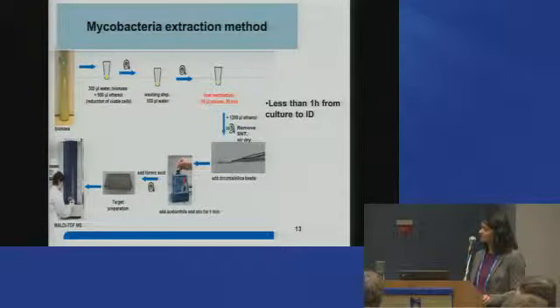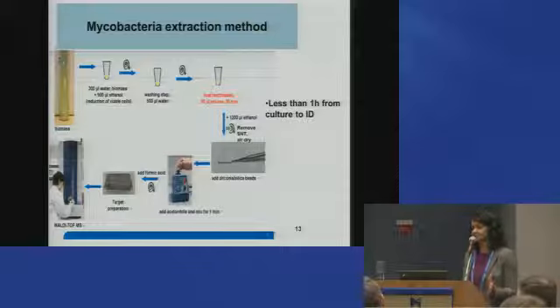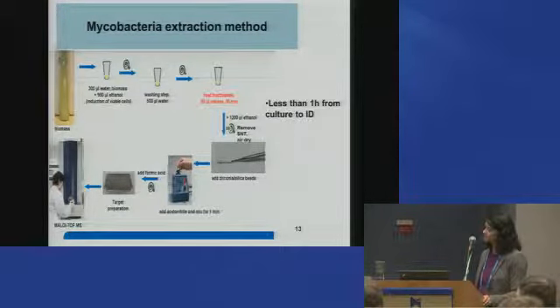And so we wanted to make sure that we were going to really process mycobacteria very carefully, which would mean that we end up first adding ethanol and then heat killing the organism at 95 degrees, and then again eluting with ethanol, and then adding your zirconium beads, because they have very thick waxy cell walls, okay, with mycolic acids in it for mycobacteria. So you really want to make sure you crack open that cell wall really well, and that you are then able to get the proteins out, which then you can add your formic acid and so on, the same steps as I showed you previously, and then spot your supernatant after going through the process onto your target plate.